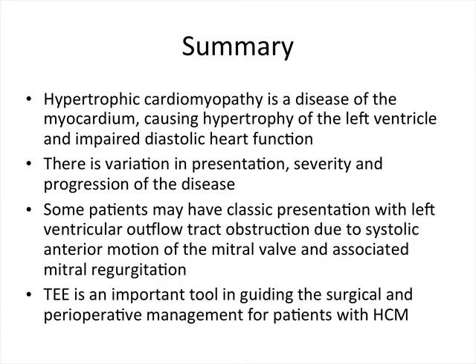Myectomy is a surgical treatment for such patients, and TEE is an important tool in guiding the surgical and perioperative management for patients with hypertrophic cardiomyopathy.